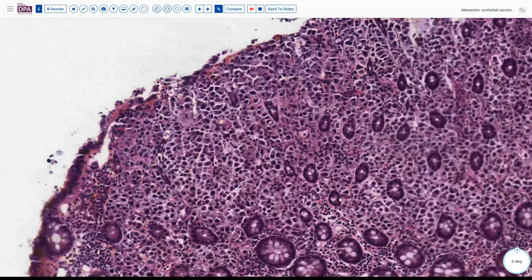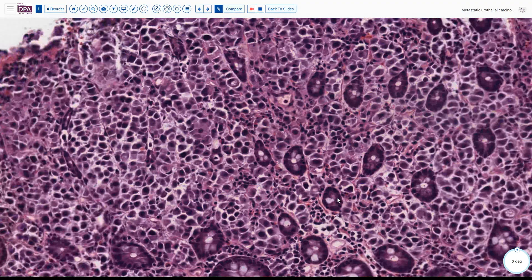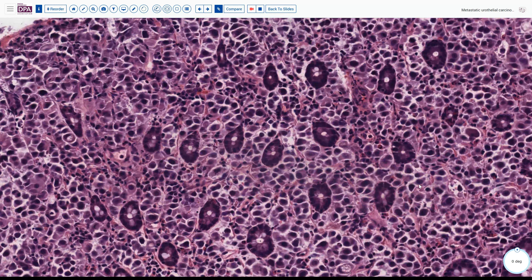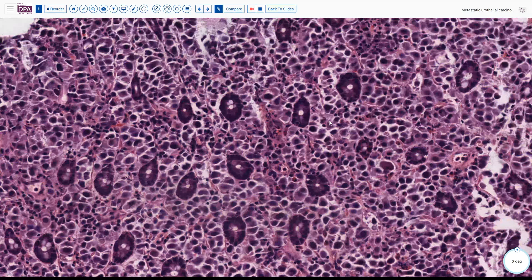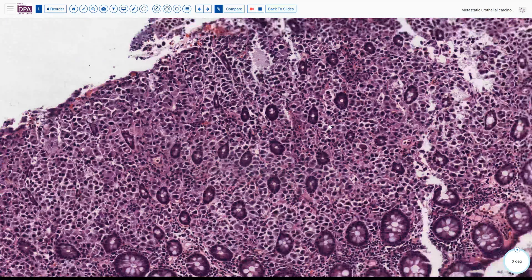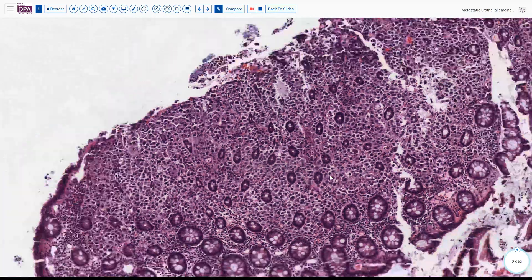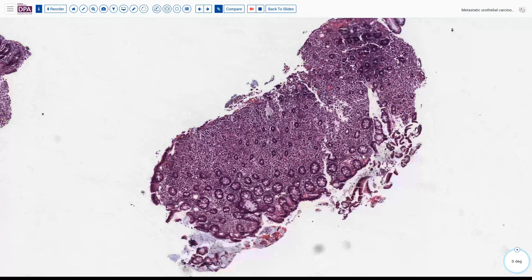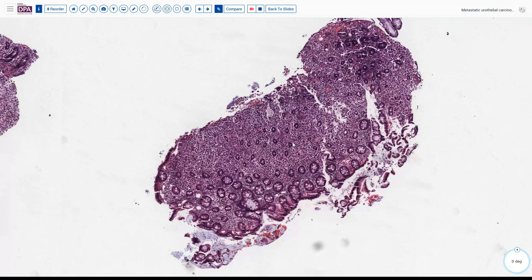Here we see the tumor extending up into or involving the mucosa, again with this eccentric nucleus and small clear spaces within the cytoplasm, obviously destructive of the underlying normal mucosa. So this is a diffuse type of neoplasm — it looks like it's probably a carcinoma, and we have some areas which show apparently a signet ring type of morphology.